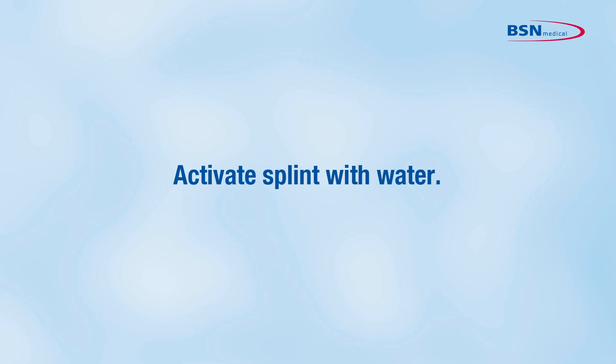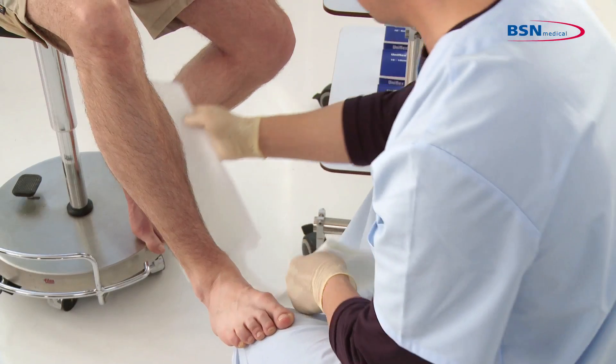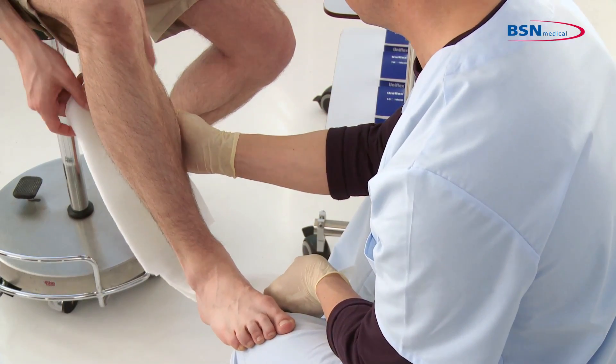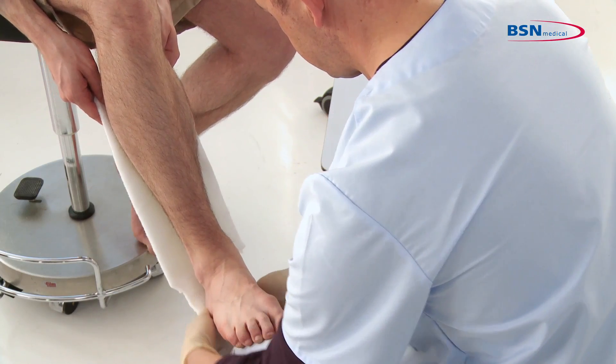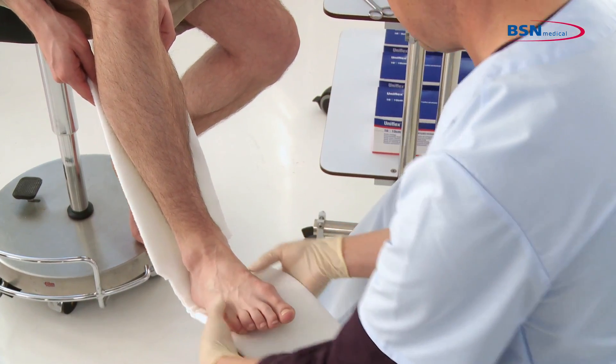Activate the splint with water. Afterwards, apply the splint to the patient. Be sure to place the reinforced side away from the patient to avoid pressure points.